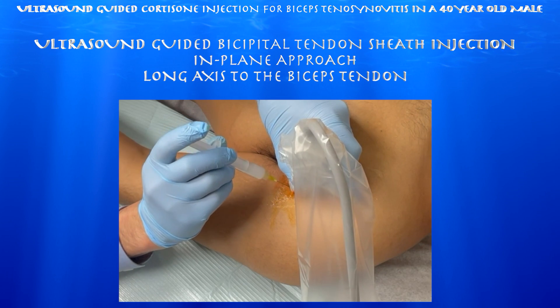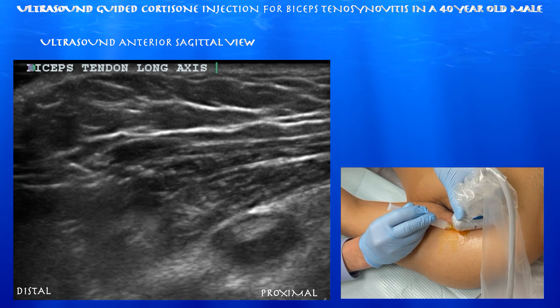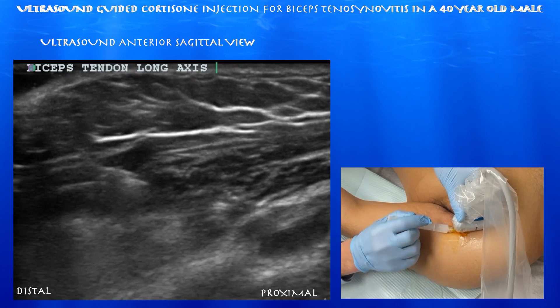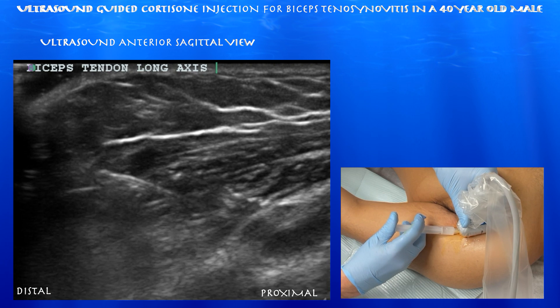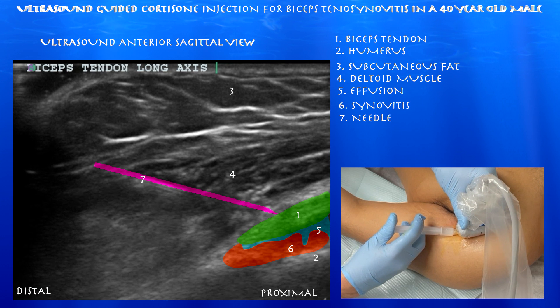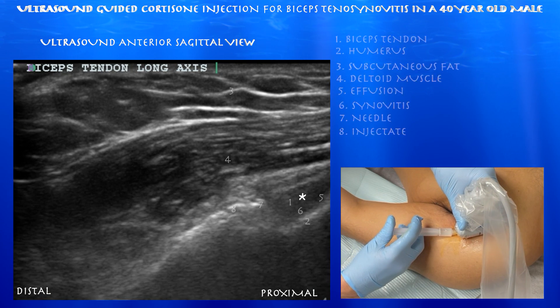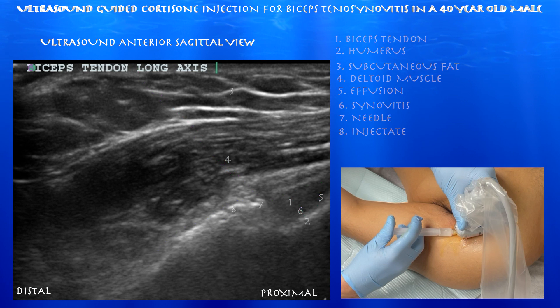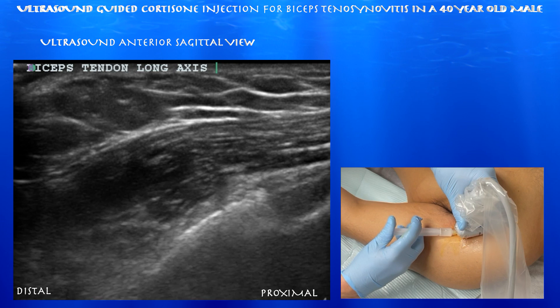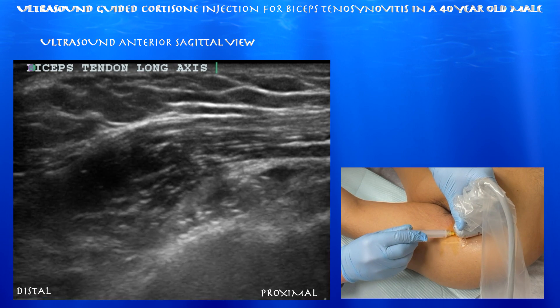Now we're starting the procedure. This is an in-plane approach, going from caudal to cephalad. We're looking at the biceps tendon in a long-axis view. The biceps tendon curves around, so it may be somewhat oblique. Here you can see the needle going right towards the biceps tendon, and you can appreciate the tip of the needle within the sheath. You can appreciate this bright hyperechoic signal around the biceps tendon, which is probably air from the injectate and perhaps the needle shaft contouring the biceps tendon. Here you can see the injectate and air within the injectate contouring the biceps tendon nicely, which confirms that you're in the correct location.